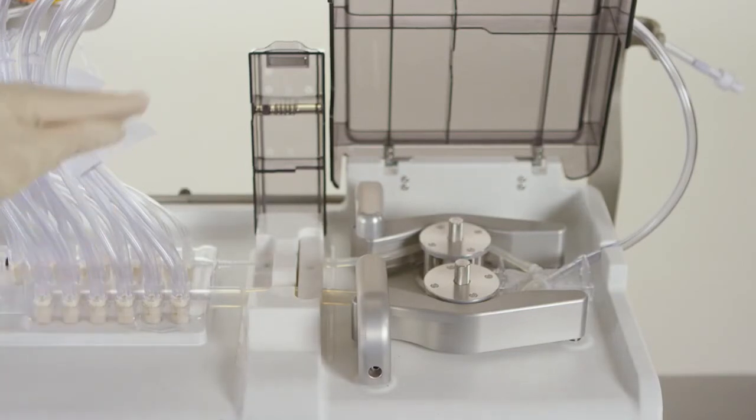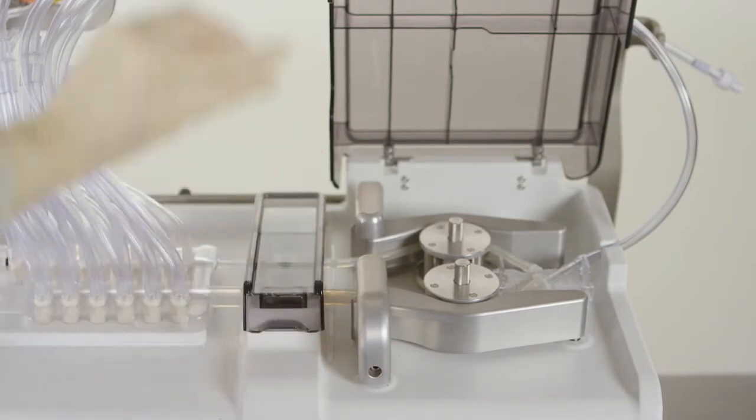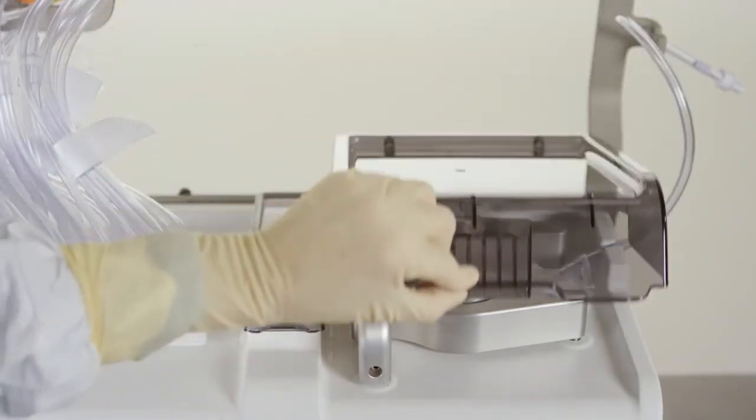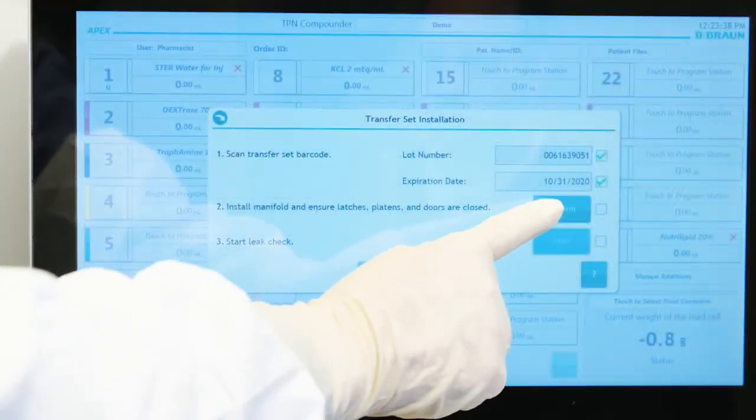Carefully lower the pump and detection sensor doors until they lay flat over the rotors and sensors. If properly assembled, you should not meet with any resistance when closing the doors. Inspect the transfer set to ensure that it appears properly installed. If it does, tap confirm.